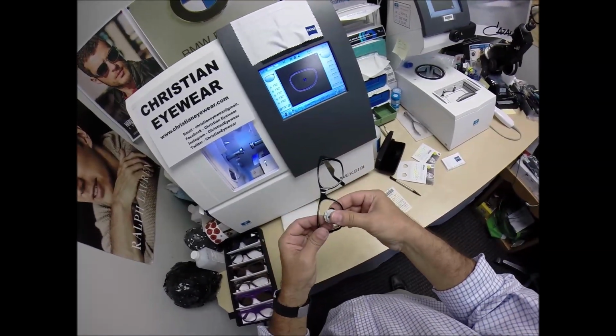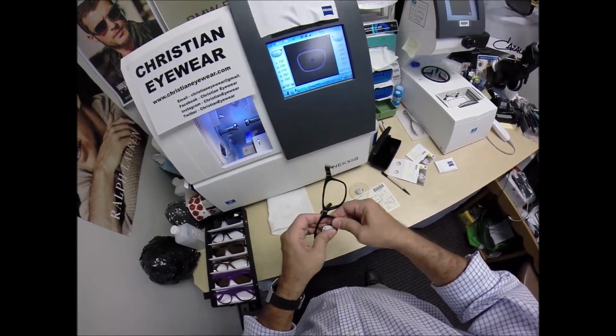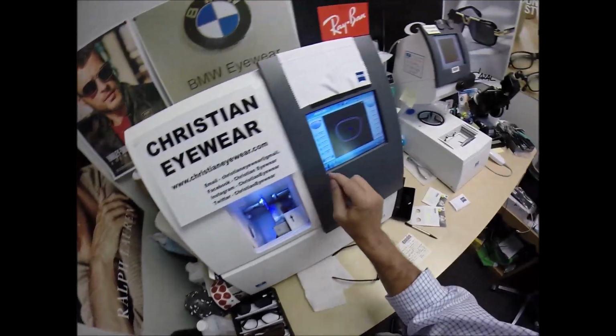So I start a little large, work my way down, tuck it in at the outside corners using my thumbs. I press down at the nose. It doesn't want to go in, so I'm going to take about another 1/10 of a millimeter off.